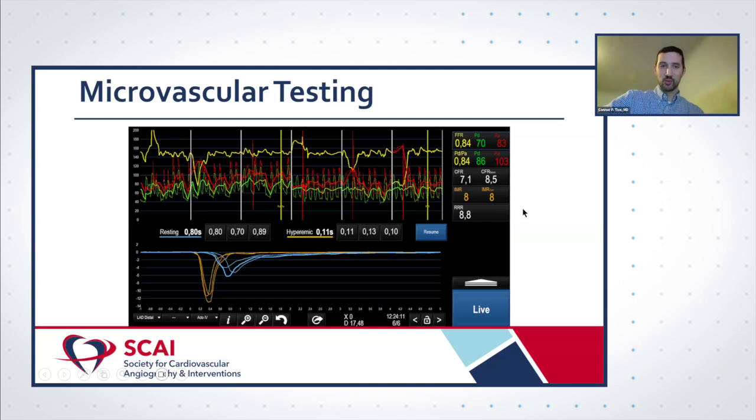Yeah, it was something that we talked a bit about when we were putting the case together and did some dives into the literature of what the ranges of normal are. And you're right, in this typical patient population, it is atypical to have that high of a CFR. In younger, otherwise minimal risk factor patients, you can see elevated CFR that is not connected to any disease. So, I don't have a great answer. Dr. Blair, I'm not sure if you make anything else of that as well.